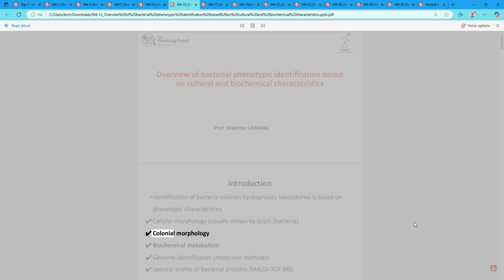colonial morphology; biochemical metabolism; genome identification, molecular methods; and the spectral profile of bacterial proteins, MALDI-TOF MS.